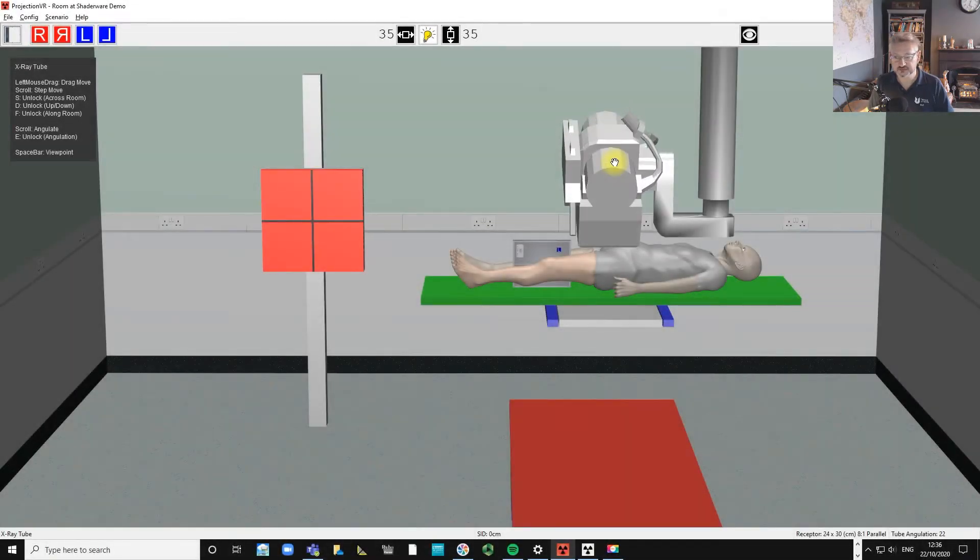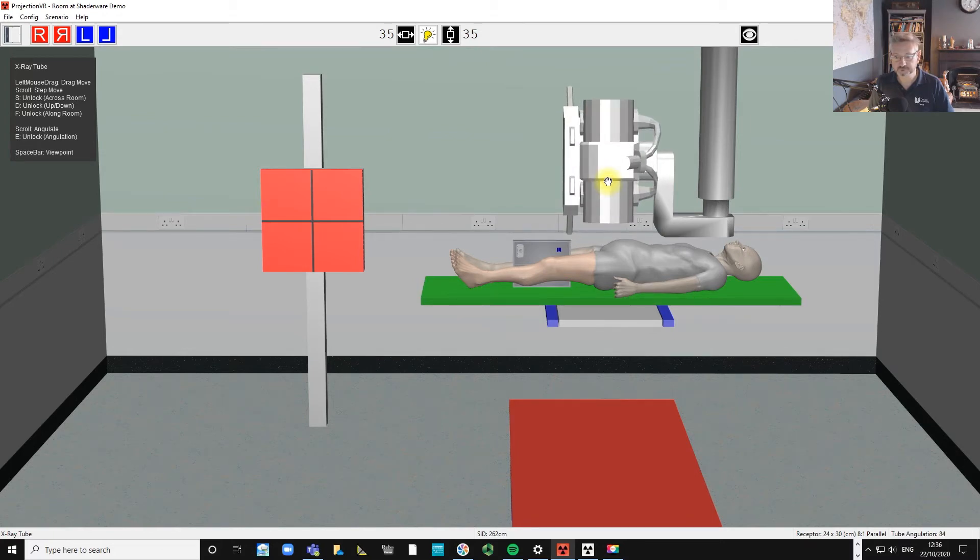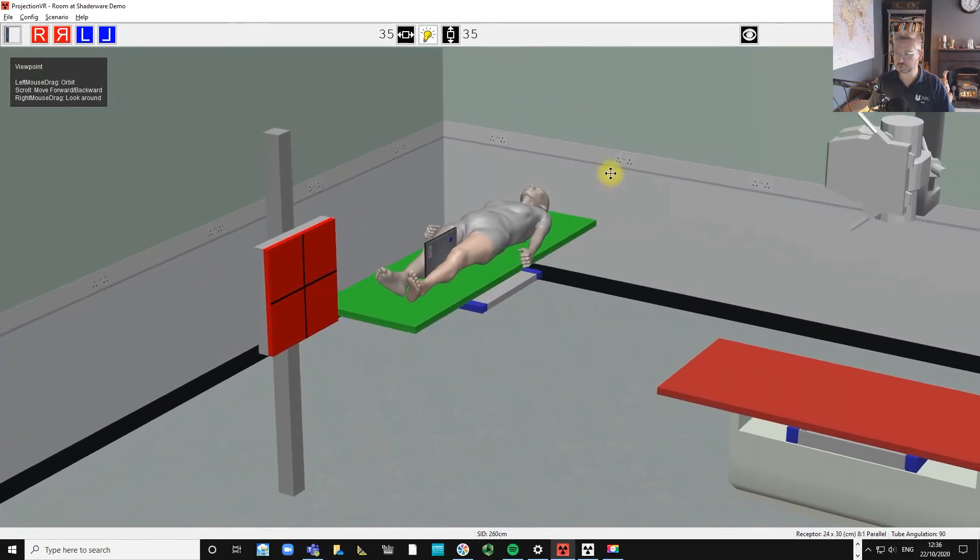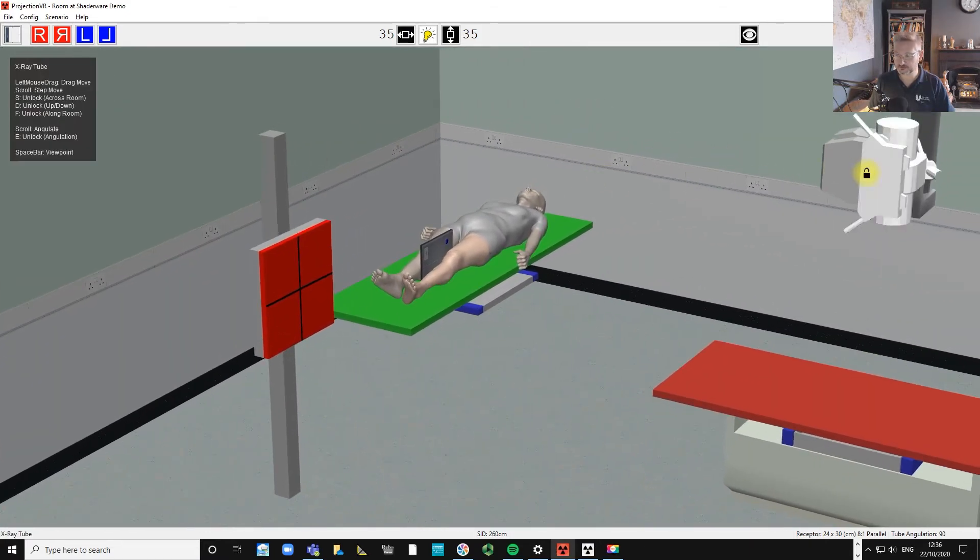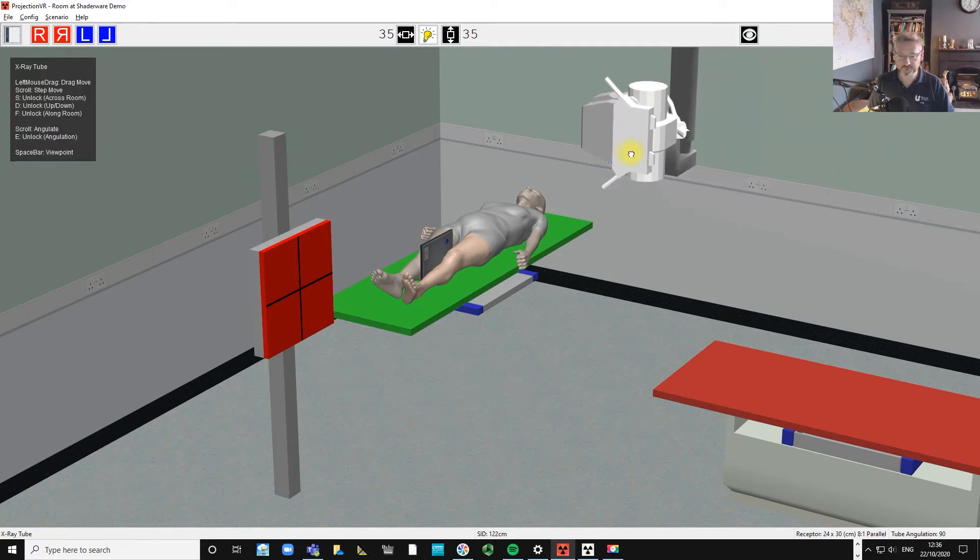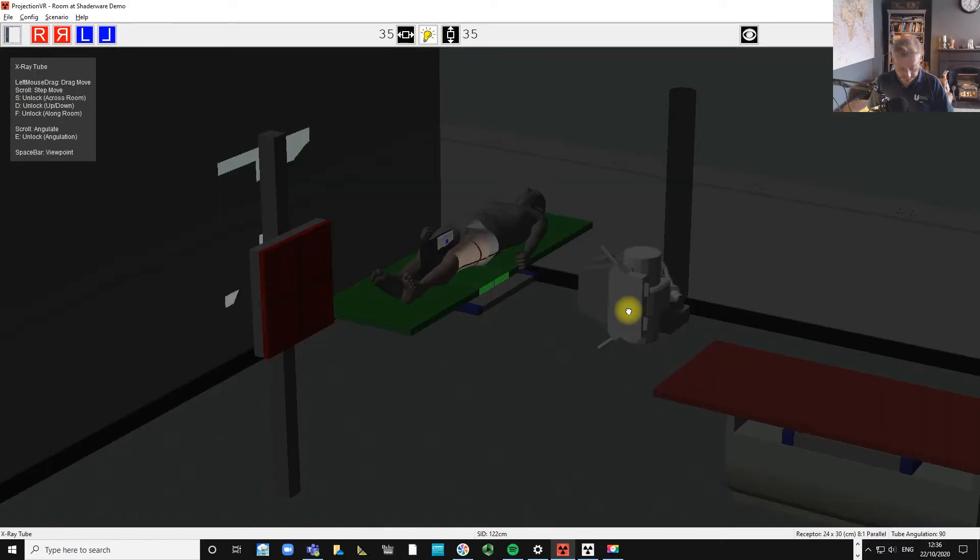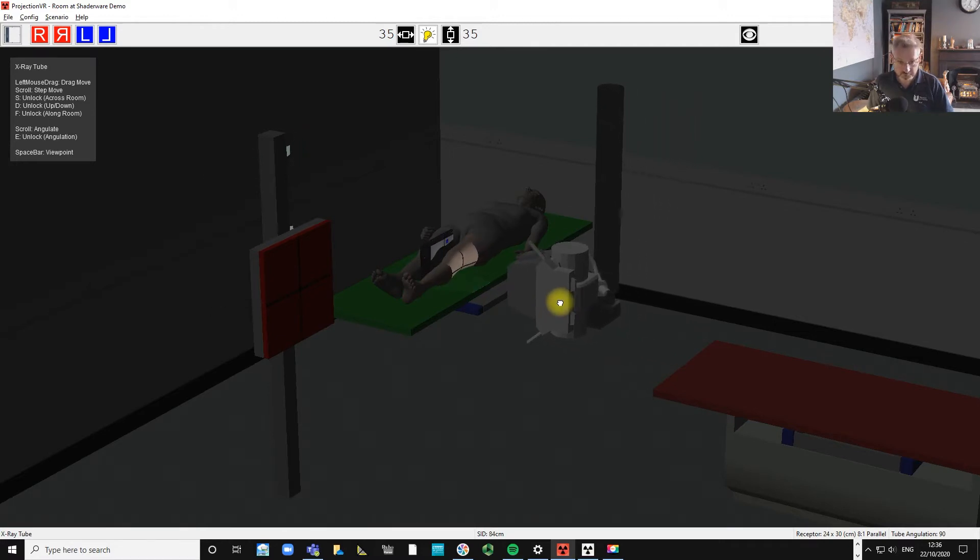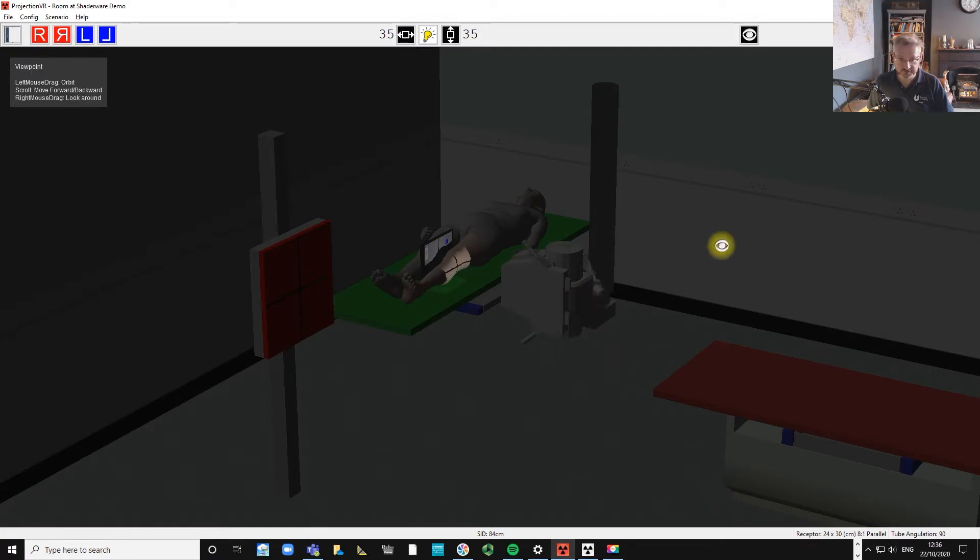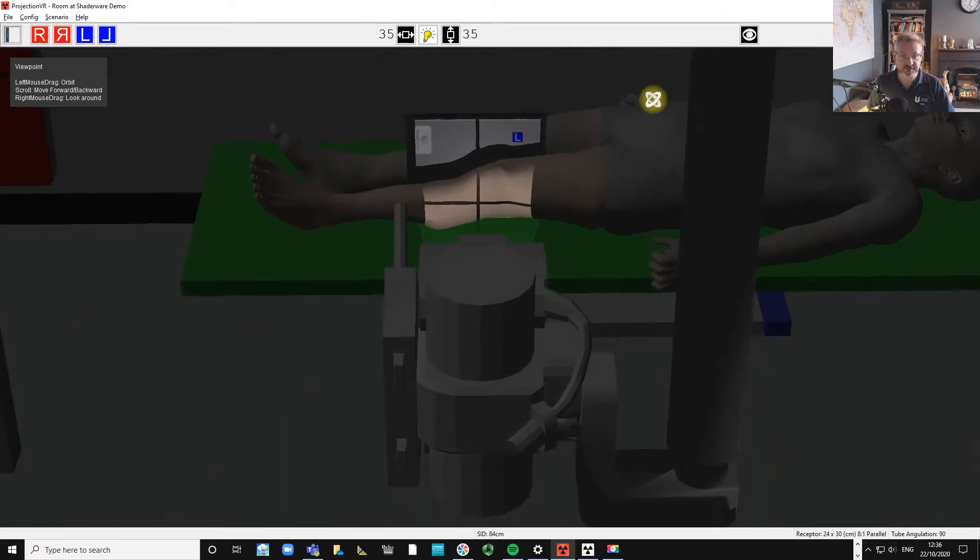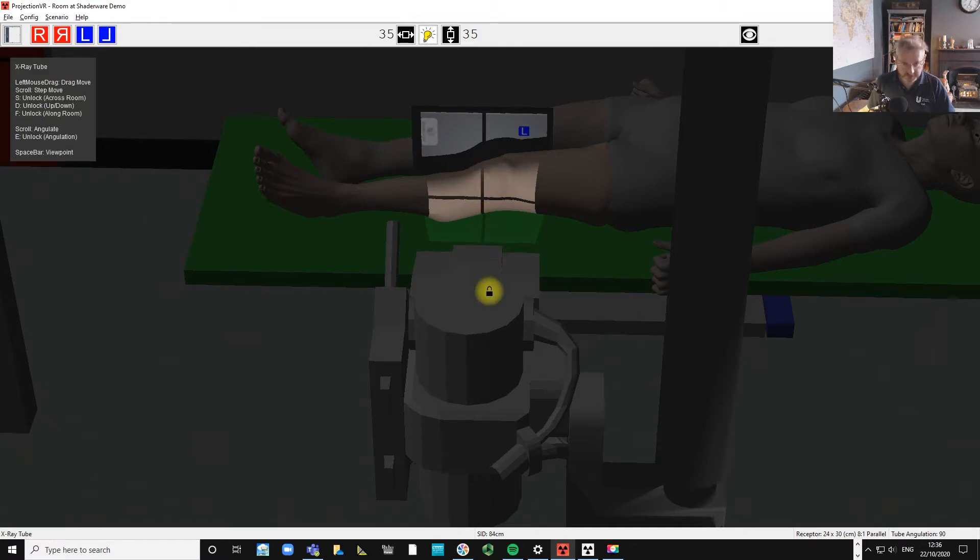We're going to rotate the tube around and bring it in to the patient and drop it down. The centering point is the same as it is for the medial lateral, in that it's an inch, 2.5 centimeters, below and posterior to the apex of the patella.